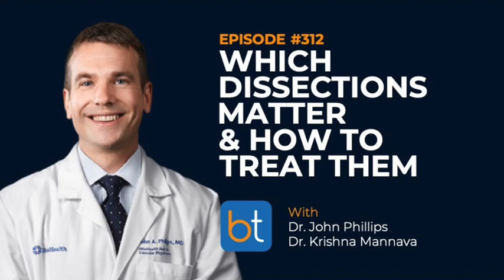That in and of itself is a little bit of a hurdle, because when we're putting stents in, our eyes look for the radio-opaque marker, but in most stents, or all stents, the radio-opaque markers are distal and proximal. So this is a little bit different. There are little radio-opaque bands between each tack. Ultimately what you have to do is loosen the Tuohy, and then, I describe it like popping a bottle of champagne and trying to pull that cork out. You don't just crank it; you kind of have to massage it sometimes.